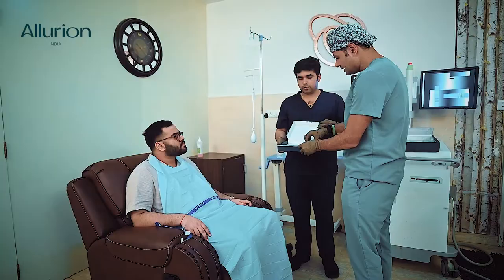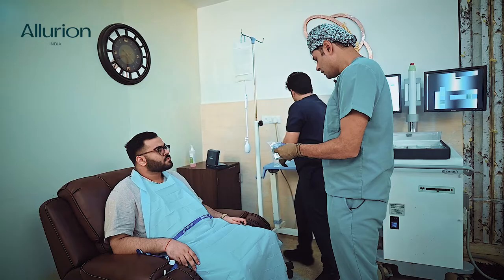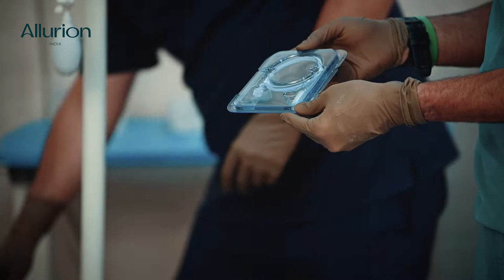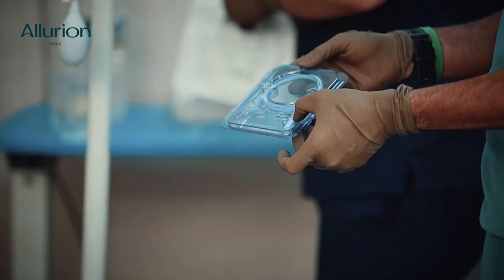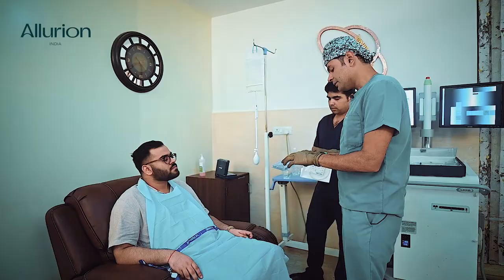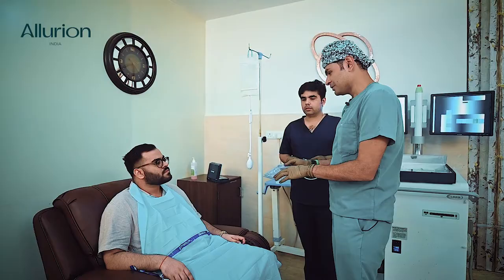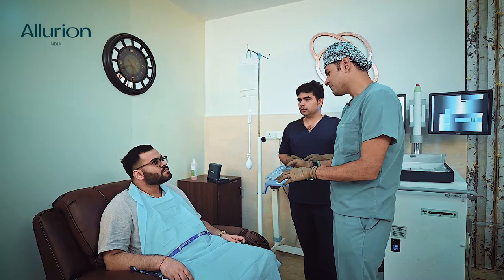This is the Ellyrian gastric capsule. I'll open this capsule in front of you to demonstrate what it is. This capsule has two parts — the first part is the capsule itself, and the second part is a very thin catheter attached to the capsule. You take this capsule with a gulp of water, then subsequent sips, and the catheter remains attached while it's inside your stomach.